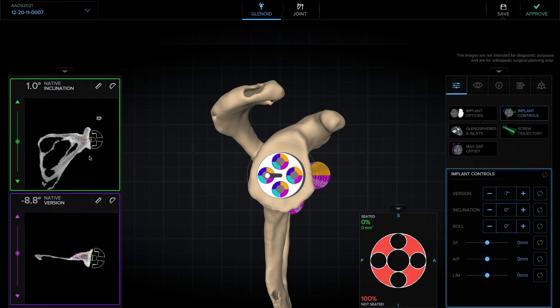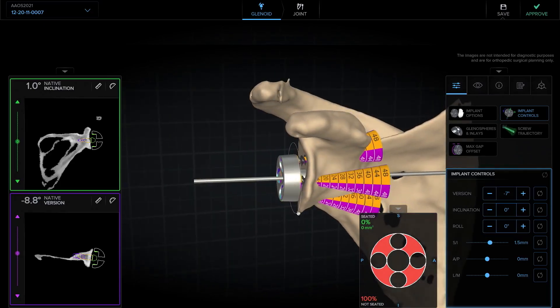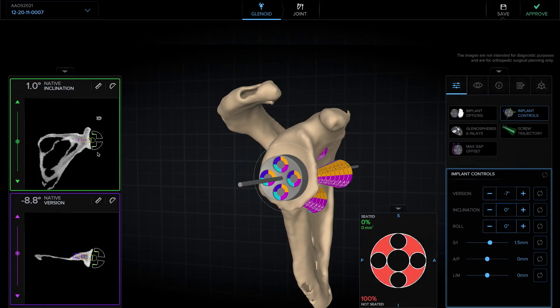Then we'll typically look at the coronal plane. I like the glenosphere to be flush or a millimeter inferior, and so that can be adjusted on the coronal plane. I can also look at the 3D to confirm this. If we look at this position here, we can see the line shows that we're flush or just inferior, and the glenosphere is sitting flush or just inferior.